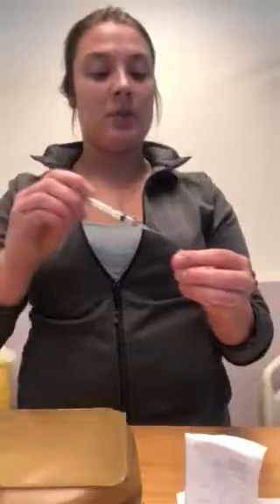Okay, so I'm breaking away from myself, always keeping an eye on my morphine. I'm just going to put it down. When I draw it up, I know that I'm going to be wasting 0.04 of morphine, so I'm just going to get my second nurse to check and initial that for me on my MAR. And she's going to watch me draw up my morphine.